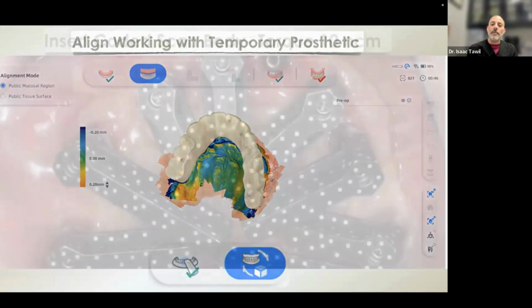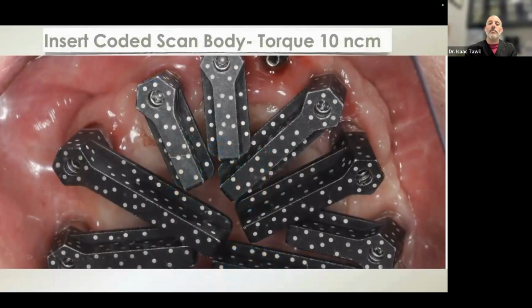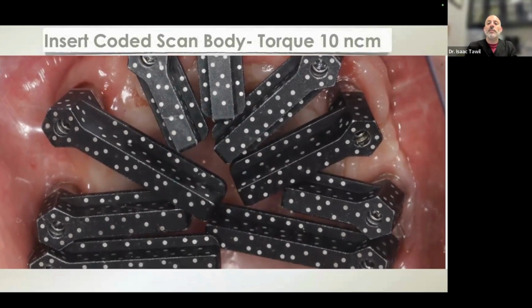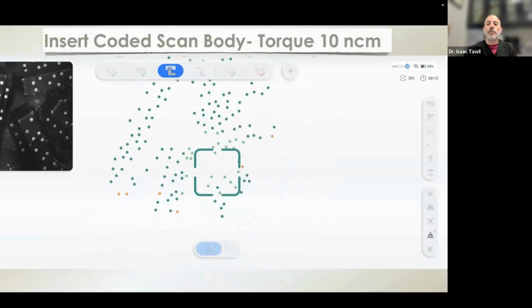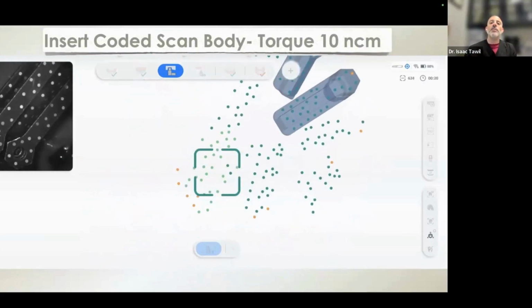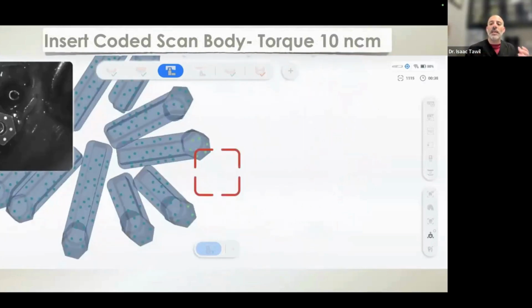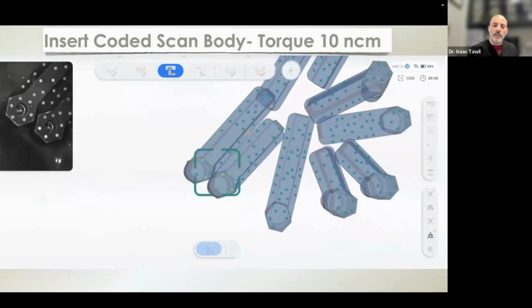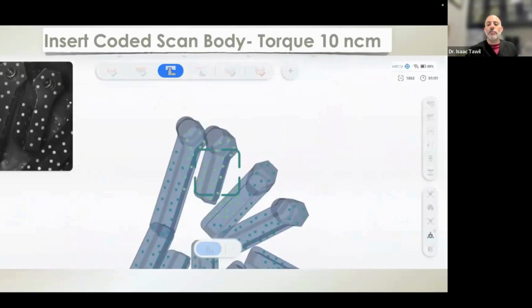We then insert the photogrammetry pieces. I scan 9 of them here. This is a big case. And we go ahead and start capturing the photogrammetry positions, getting as much overlapping data as possible. And what you'll notice here is I'm capturing and it's importing them based off of me moving from one to the other. So I get enough data. I'm working on high speed dubbing here. This is not real time, but I'm going back and forth capturing the data.